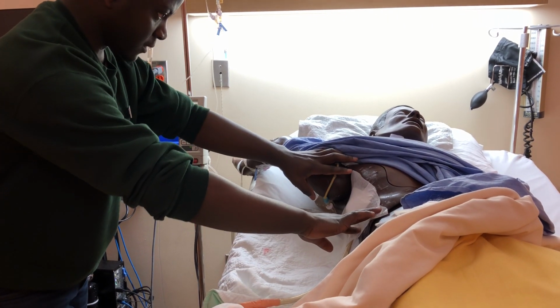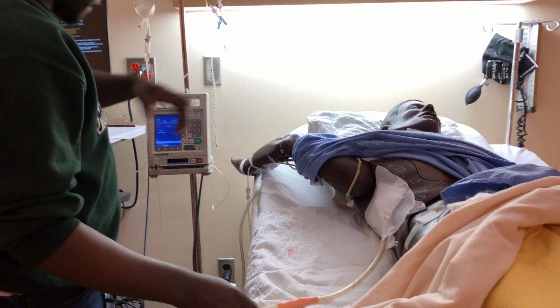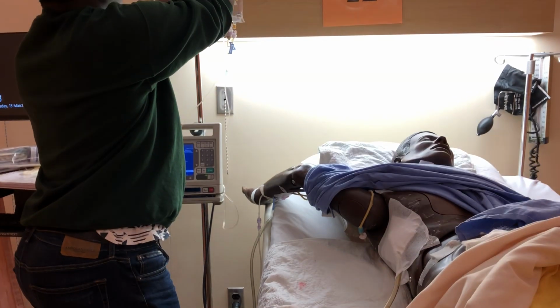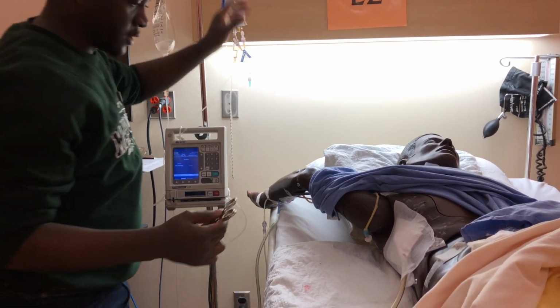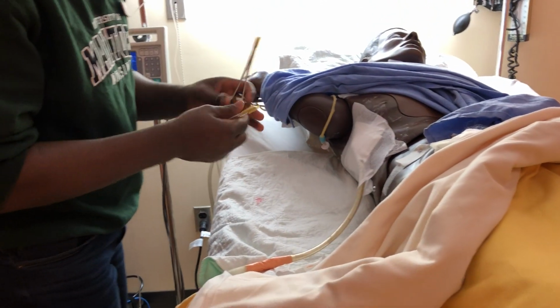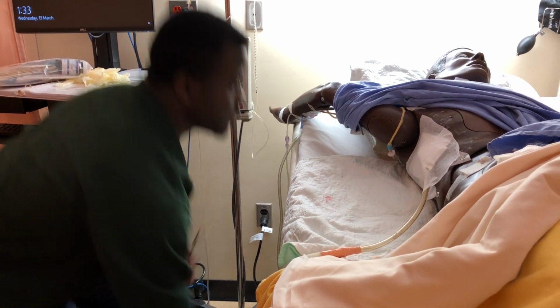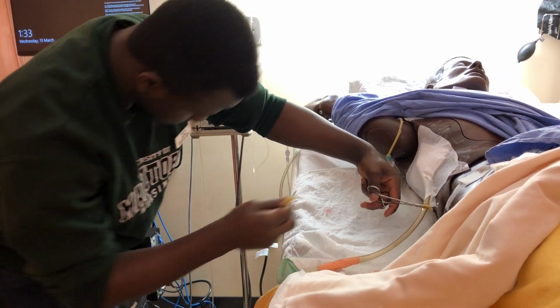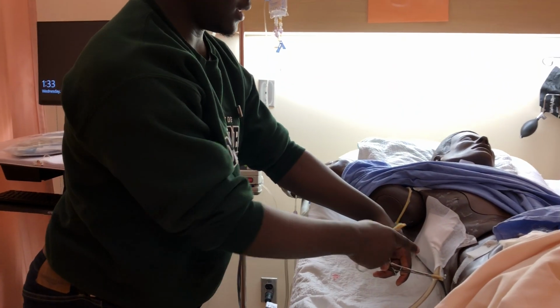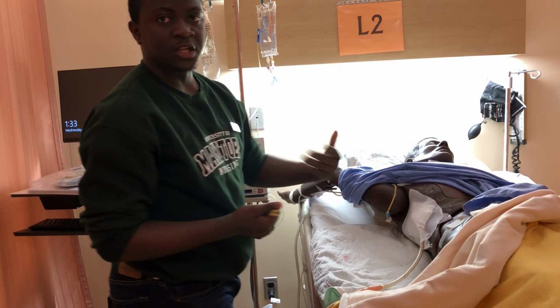I'll inspect to see that it's intact, and as I see that the dressing is dry and intact, I will just use my clamps to check whether there's an air leak. As I clamp, I will start clamping closer to the patient to check whether the air leak stops. As I clamp here, I see that the air leak stops. I know that this is where the air leak is from. So when I do my dressing change, I know that should stop the air leak.